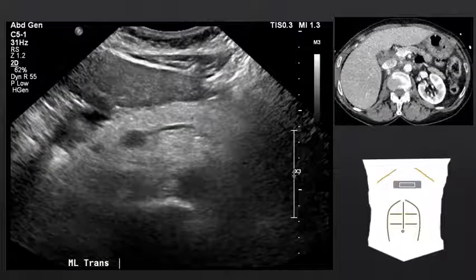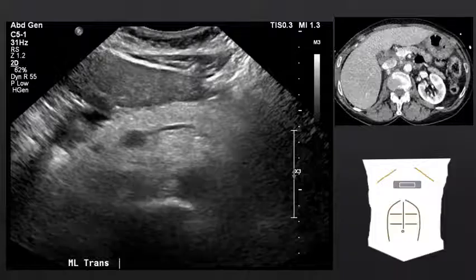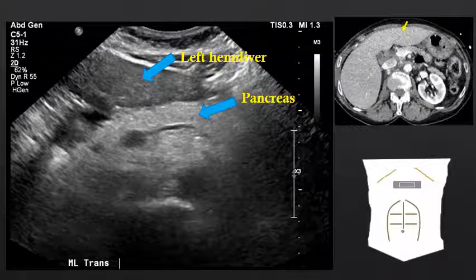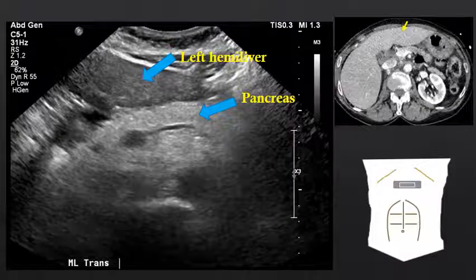If we move slightly inferiorly but remain in a transverse orientation, the left hemiliver is still the most superficial solid organ. Deep to the left hemiliver, we now can see the pancreas. The pancreas is hyperechoic to the liver, and we can see it there on CT.